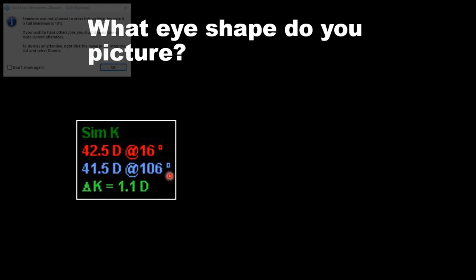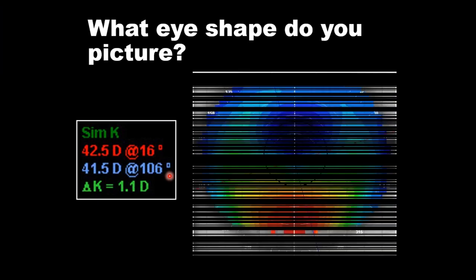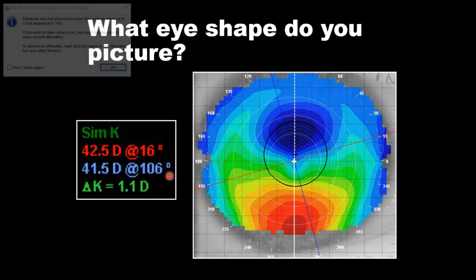Otro ejemplo — lo mismo, en este caso es astigmatismo en contra de las reglas, a 106 grados, 1.1 dioptría. Imagínense cómo pudiera ser la forma de la topografía. Now here's the topography associated with these K readings — this is a highly irregular cornea, a post-LASIK ectasia.